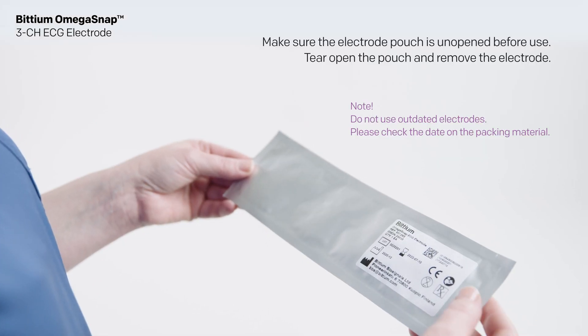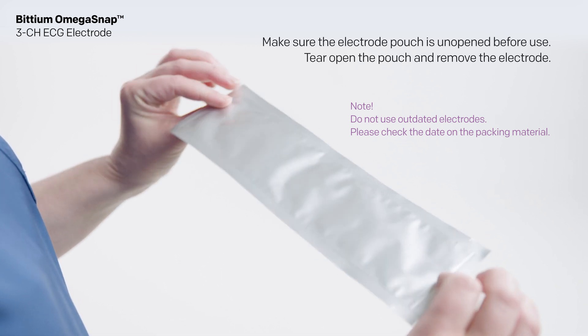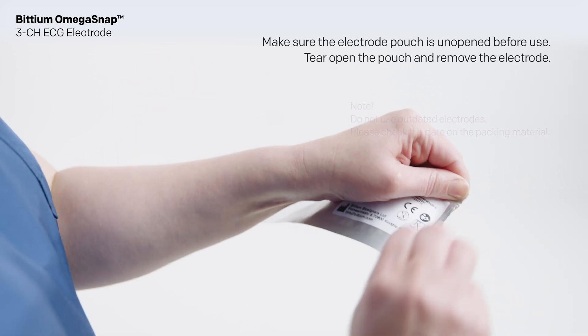Make sure the electrode pouch is unopened before use. Tear open the pouch and remove the electrode.